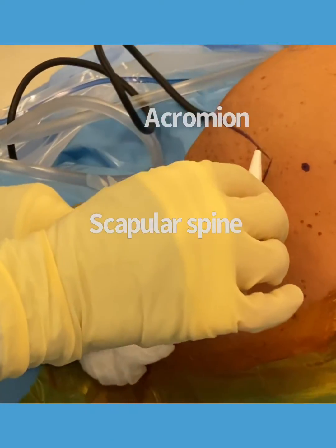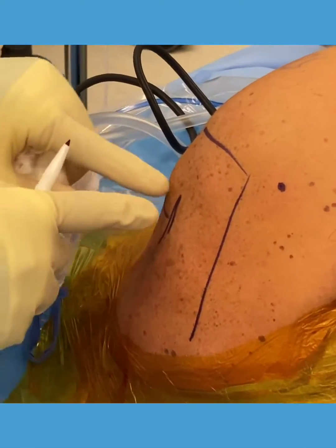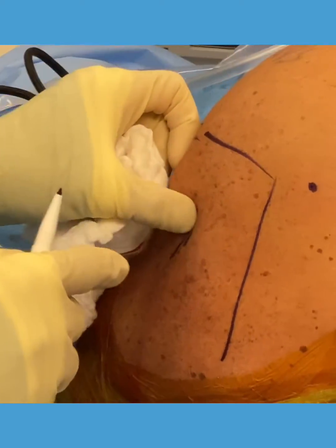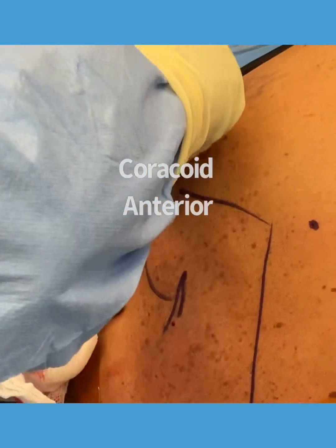So here's the spine of the scapula, the lateral acromion, the clavicle over here, the AC joint — AC joint right there, coracoid over there.